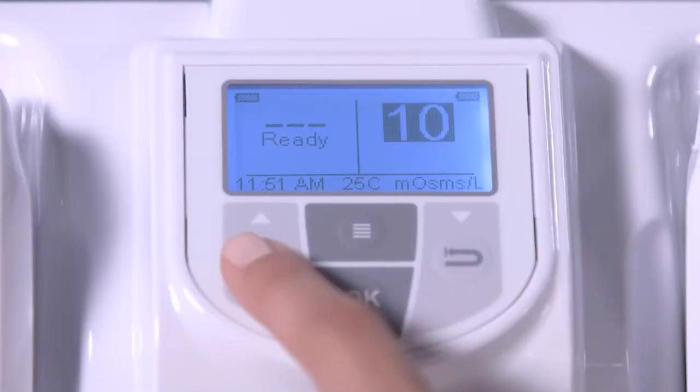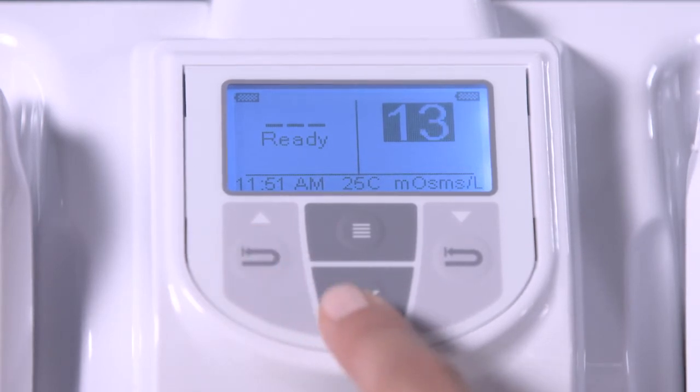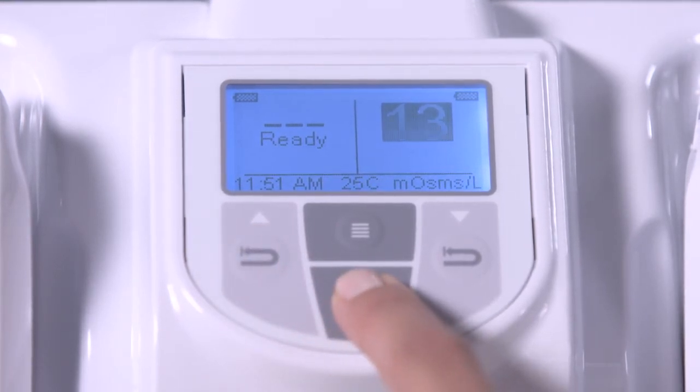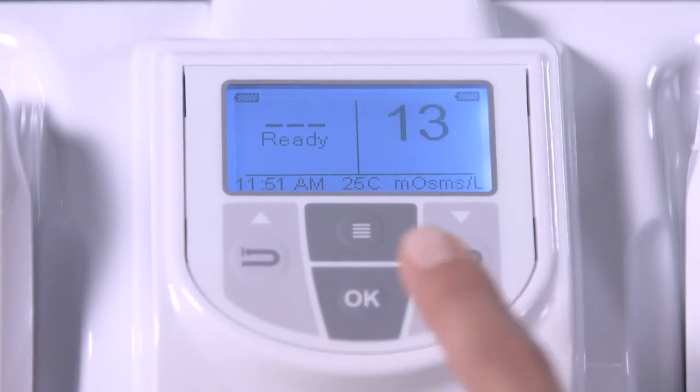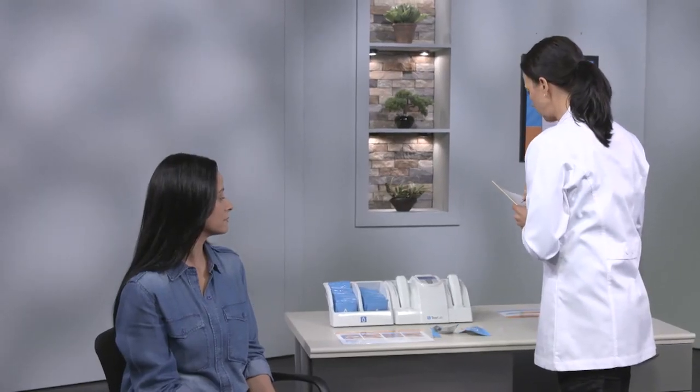Dock the pen into the TearLab within 40 seconds and note the numeric code on top of the test card. Enter the numeric code by pressing the recall buttons below the up and down arrow keys on the TearLab. You have eight seconds to match the codes. Press OK to accept the code, wait for the result, and record the result in the patient chart.